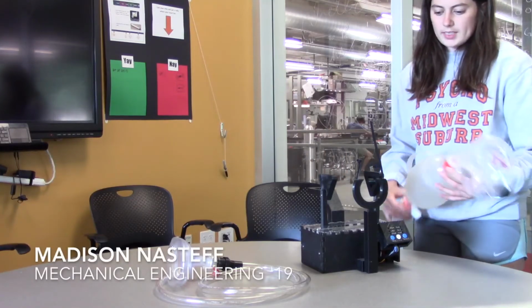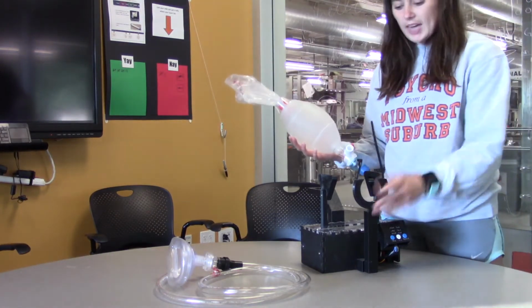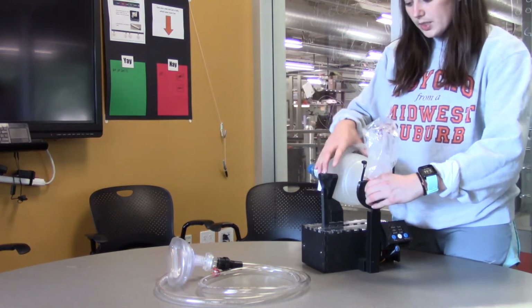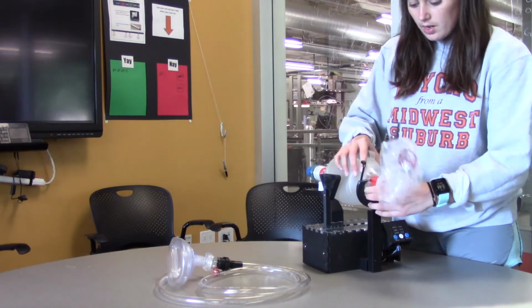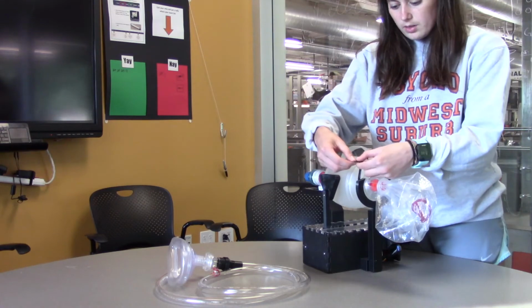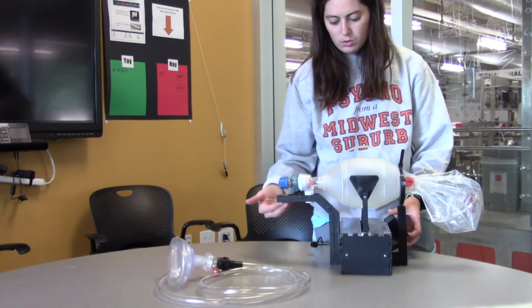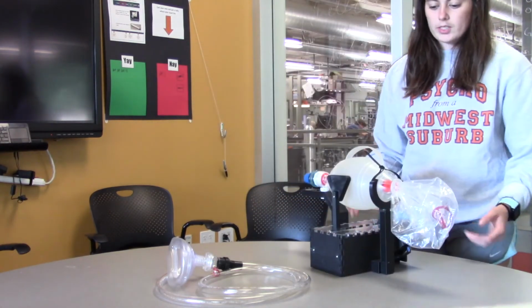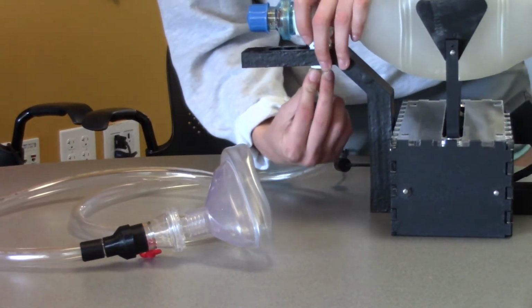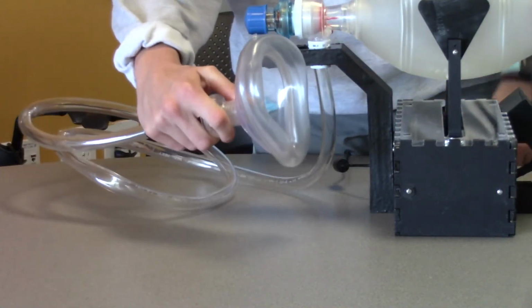The first step in our process is attaching the bag valve mask to our device. In order to do so, we have a back attachment and a front attachment. You simply put the bag in, squeeze it a small amount to get it inside the compression, and then snap the back on like so. You attach it like this, and then the front will slide into one of these 4 holes. So our device is adjustable for all types of bag valve masks. Once you've attached the bag valve mask, you attach this tubing to the bottom, and then this part will go off into the patient's airway.